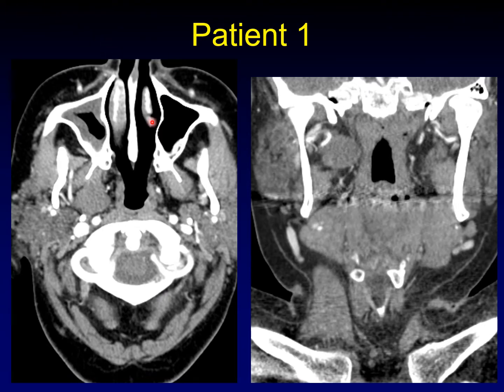Here's patient one. This is the mass in question, and you can see it here on a coronal reformat. As promised, it is pre-styloid.